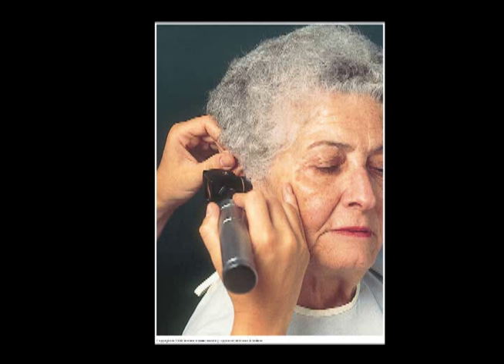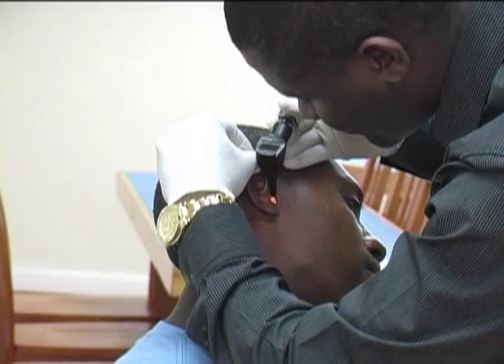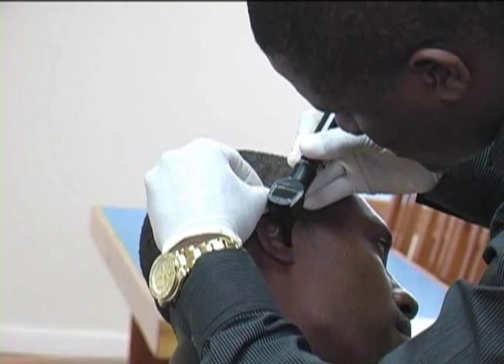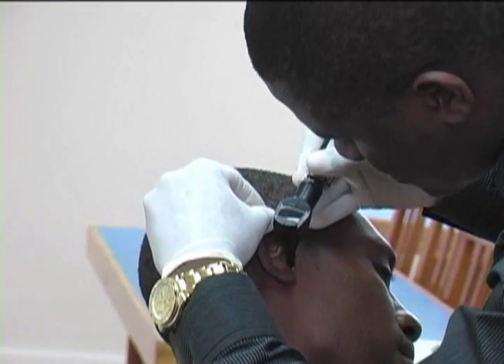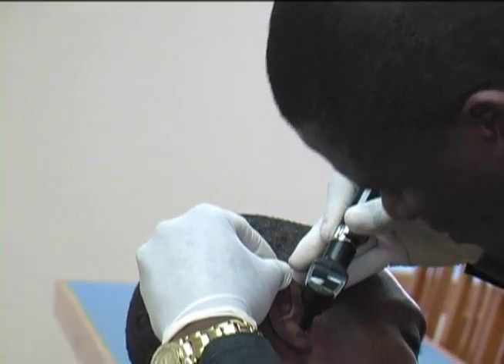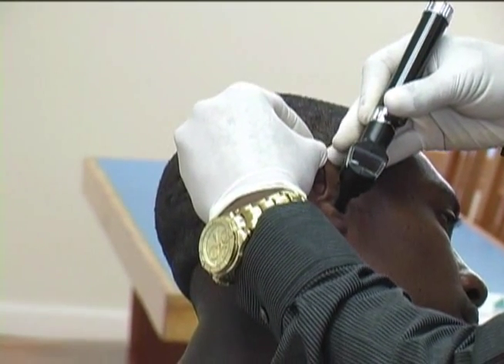Attach a disposable speculum, the largest that can be easily accommodated in the ear canal, to the otoscope and insert the speculum of the illuminated otoscope into the ear canal under direct vision. Hold the otoscope like a pen with the index finger and thumb, resting the remaining extended fingers against the scalp to prevent sudden deep penetration of the speculum, which can damage the tympanic membrane.